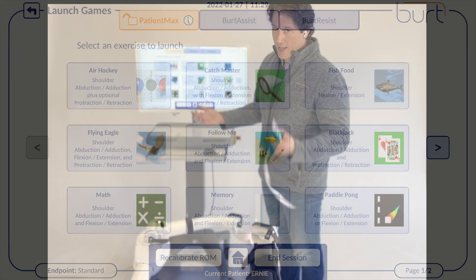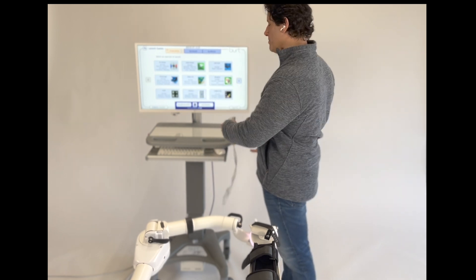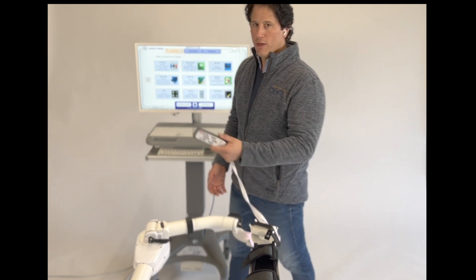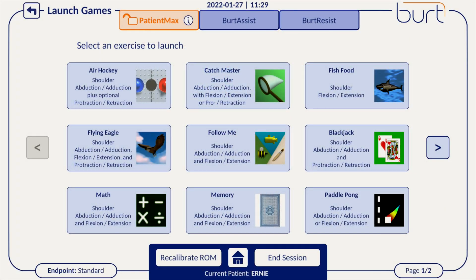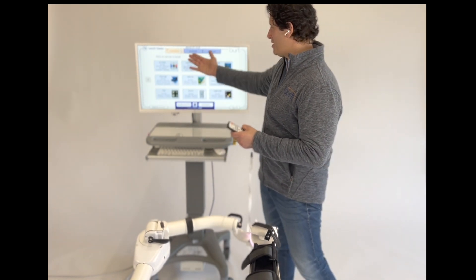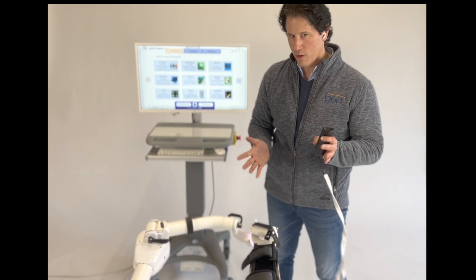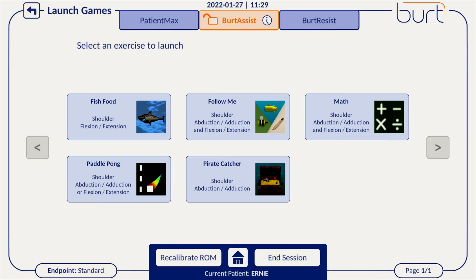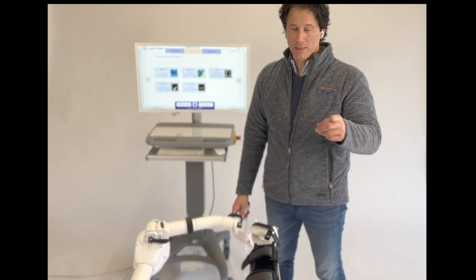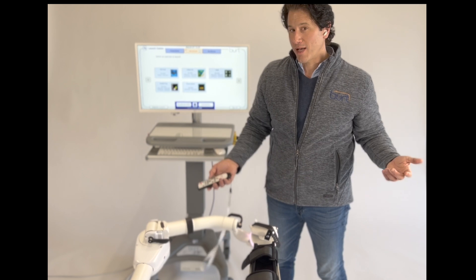So here we are in training. I have a remote control designed to let you as the therapist interact with your patient without having to come up to the machine. You can do everything with this remote that you can do with the mouse and keyboard. We have three modes: Patient Max, BurtAssist, and BurtResist, shown at the top of the screen. Patient Max means the patient is doing all the work — other than the gravity elimination, the patient does everything. In BurtAssist, the Burt is assisting — there are motors in the machine, so it's moving the patient through space to places they can't go on their own.